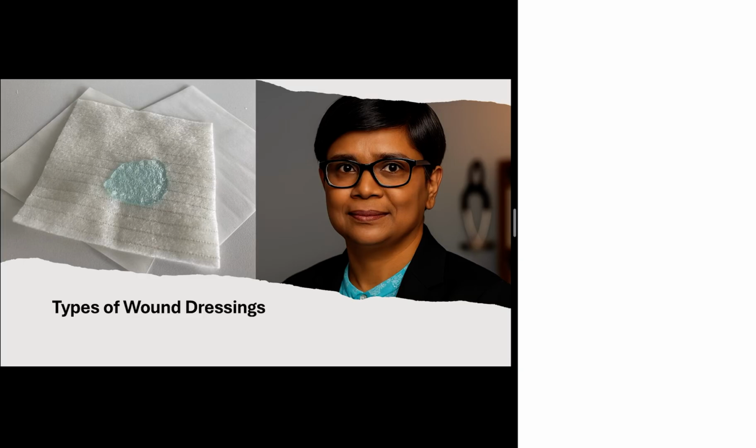In this video, we will learn about the types of dressings. Following wound debridement and cleaning, a suitable dressing is applied to the wound and changed appropriately to maintain an optimal healing environment. In addition, wounds must be continually monitored as their characteristics and dressing requirements change over time.